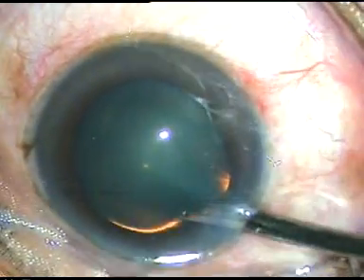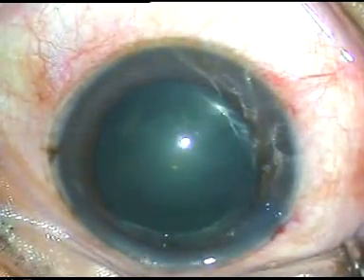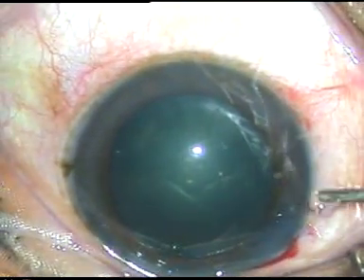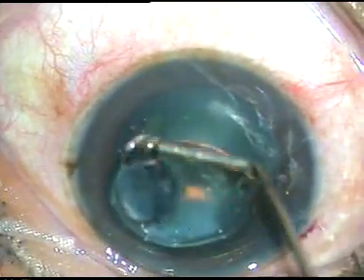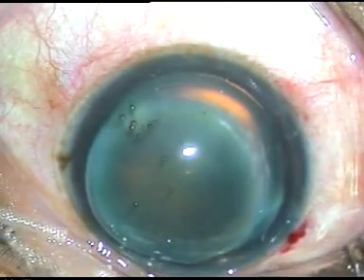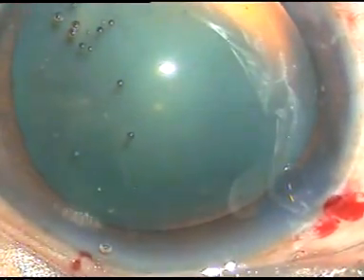Now the capsule is stained with trypan blue. The dye is washed out, a little bit of adrenaline has been used, and this is the viscoelastic substance — hydroxypropyl methylcellulose 2%, a beautiful viscoelastic substance. Now I have gone to higher magnification and I'm going to do capsulorhexis.